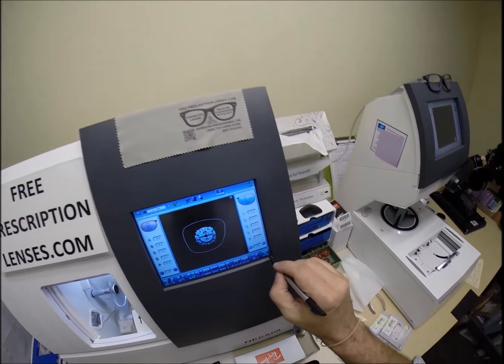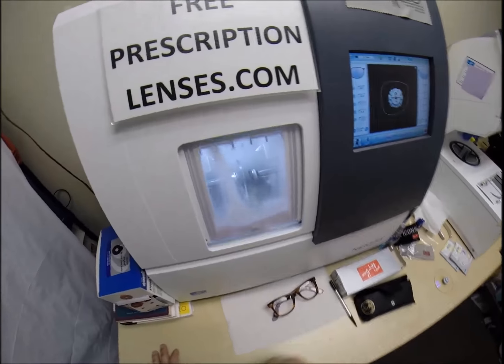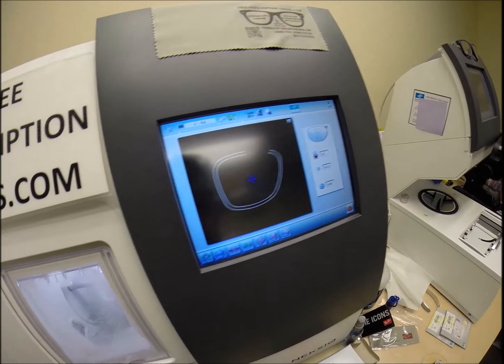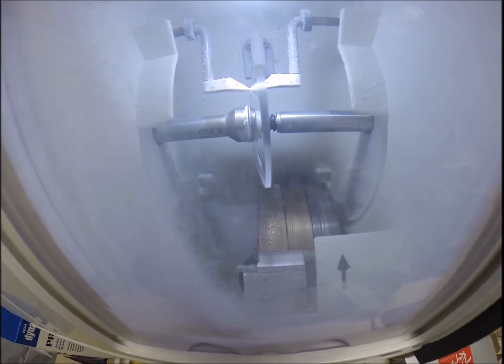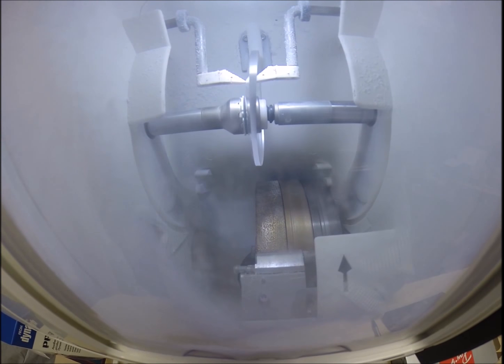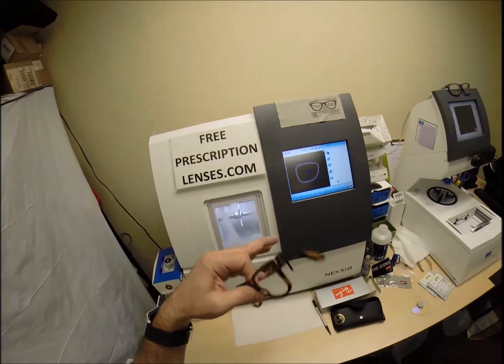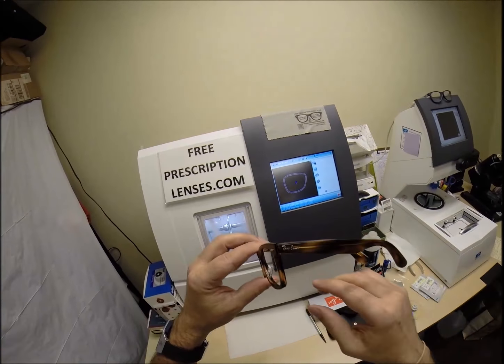So let's hit the green arrow, which is start in every language. The door closes, the clamp shuts, and then the lens is going to be traced by 2 white styluses, making sure that it's large enough to fit into the frame. You can see as it's going around tracing the shape, measuring the thickness of the lens at every point to know exactly precisely where to place the bevel so you have the least amount of edge thickness showing, of which your prescription in this frame you won't have any. You won't have nothing, I tell you, nothing.